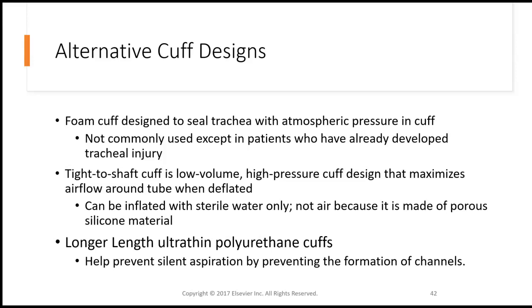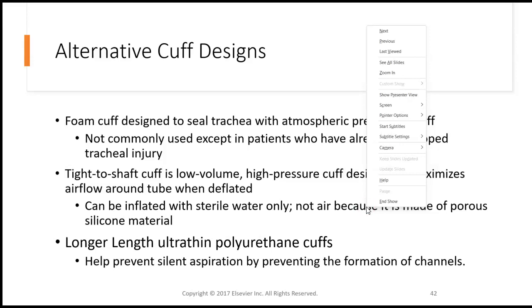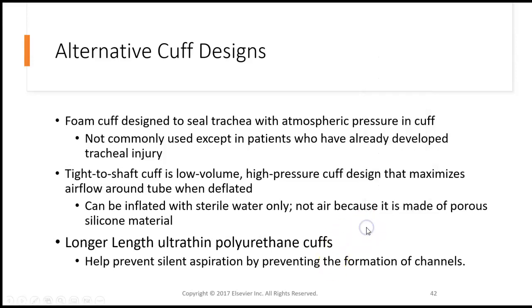These longer length, ultra thin cuffs are designed so that when they're inflated in the airway, they end up being a more smooth, universal seal.